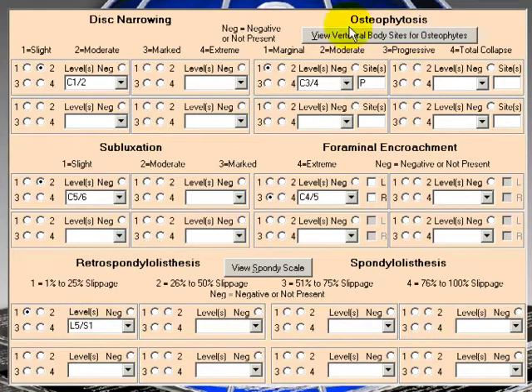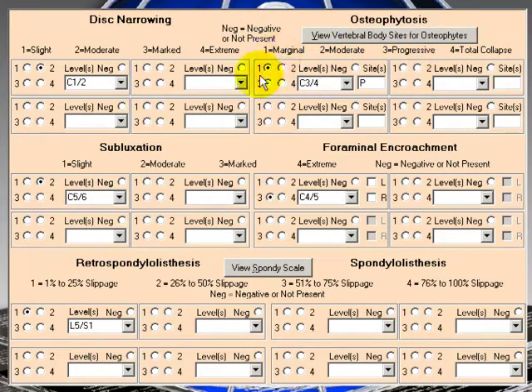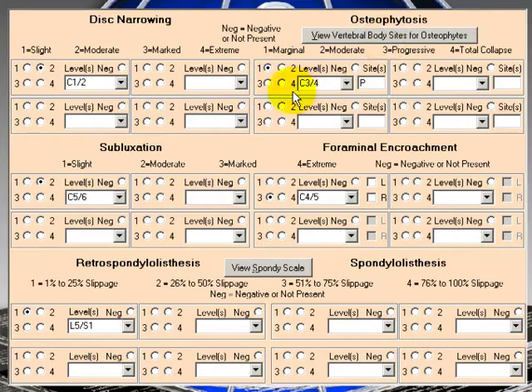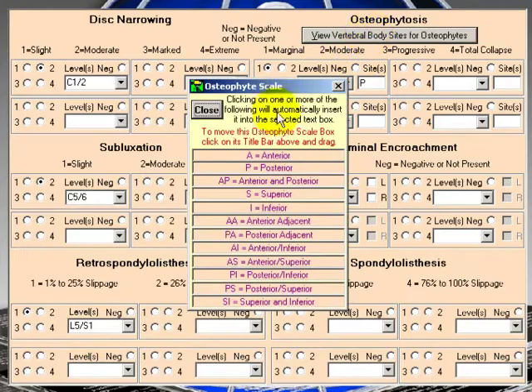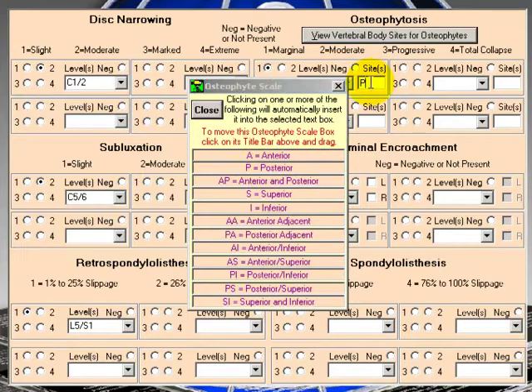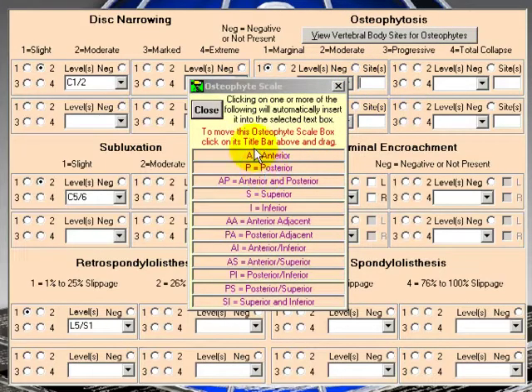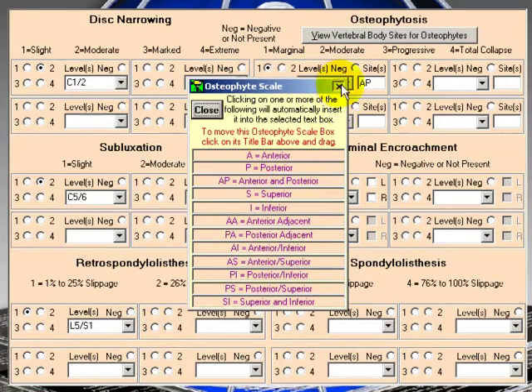Then up here we have osteophytosis. Here we have, again, here we have marginal, moderate, progressive, or total collapse. We have marginal osteophytosis at C3 to 4. There's another element here, which is sites. Now, notice this gray button here. If I click it, it shows you these are your osteophyte, this is your osteophyte scale. So the way that that P gets in there, I'm going to take it out there. You just click on whatever you need here. Let's say anterior or posterior. I click it, pops it in there.